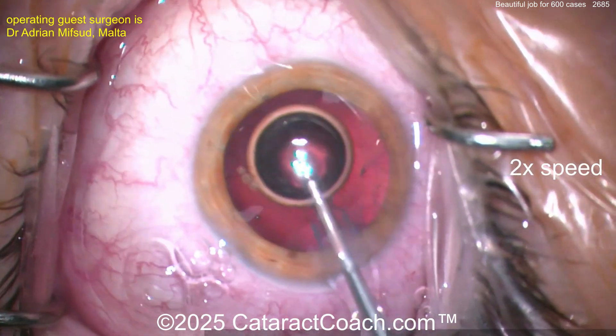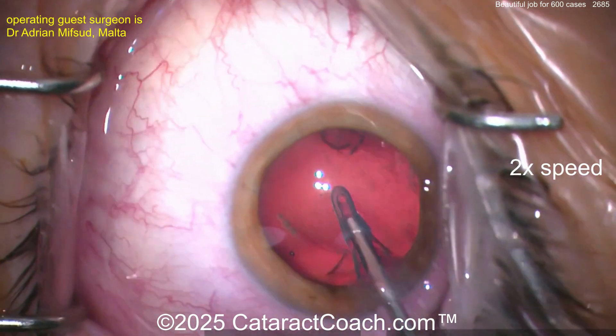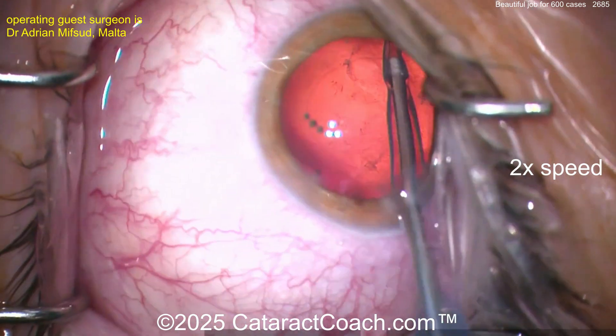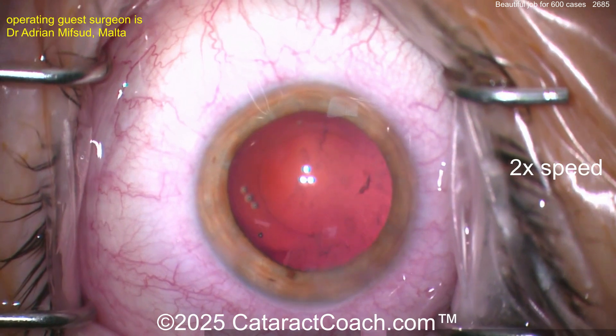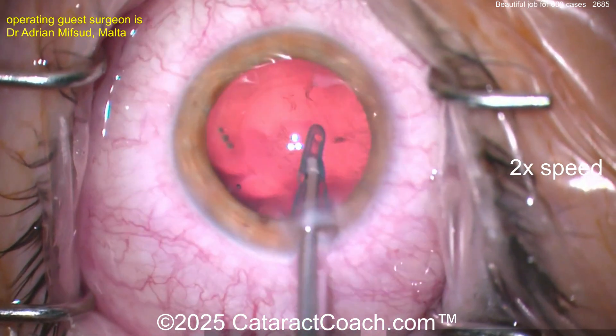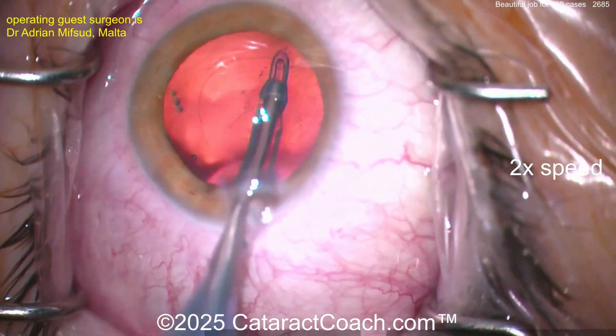Now cleaning up the cortex here — get that air bubble out. Pretty good job keeping the eye in primary for most of the case. I do like that. The draping is good, the eye position is good — patient's eye is mostly staying in primary. Capsular bag clean, clean up a little bit more. I'm glad you put that probe back in the eye — I'd get some of that wispy stuff out too.